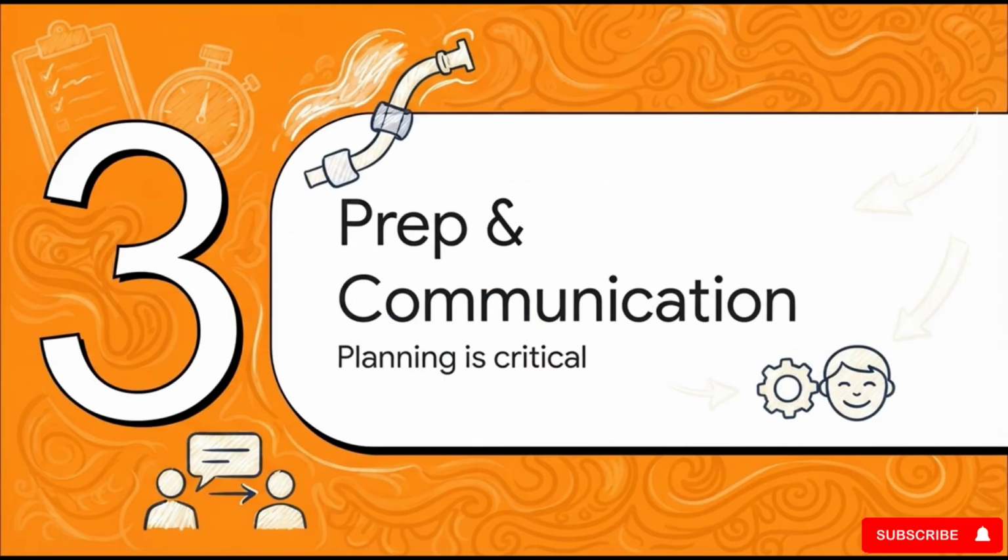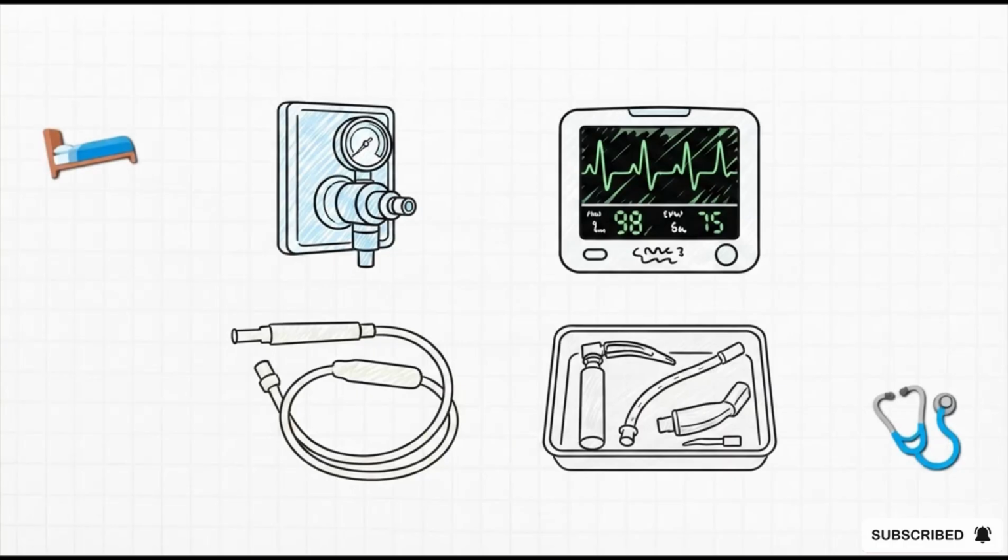Okay, jumping into Section 3, prep and patient communication. You absolutely cannot just wing an awake intubation. It is a heavily planned, incredibly deliberate strategy. It is for sure not a technique you try to improvise halfway through a crisis. The essential preparation checklist is strict.